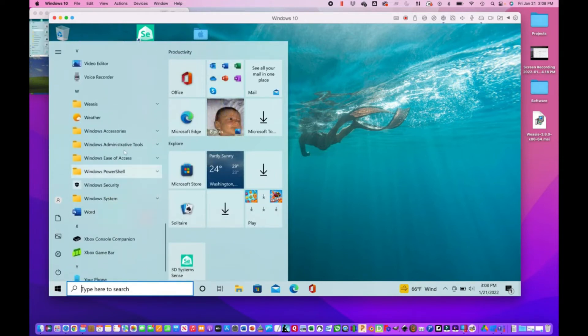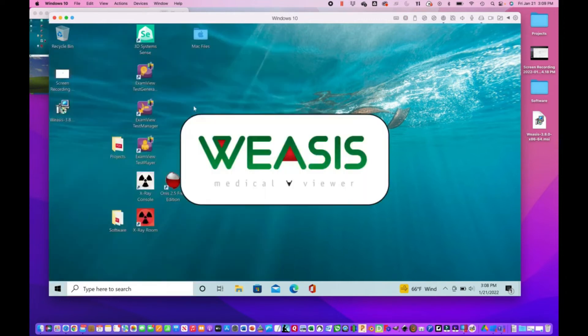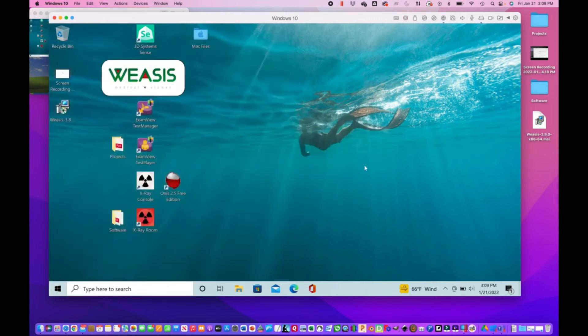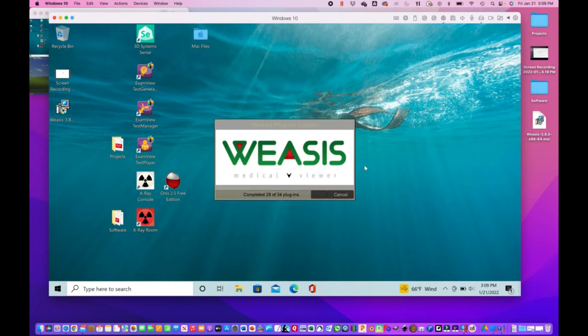There we go, and it should run right out of the box. I have another video for configuration of this program.